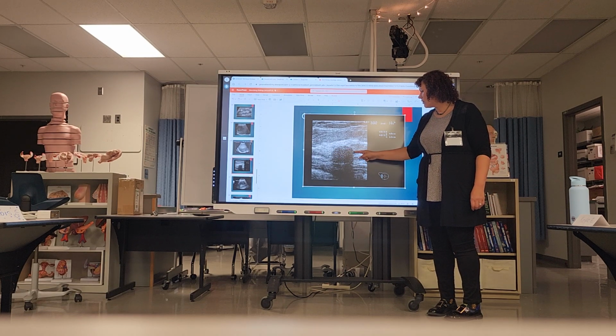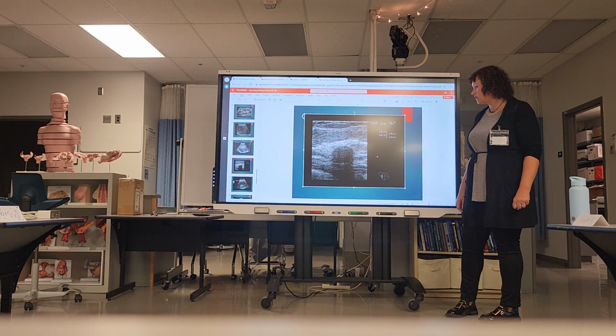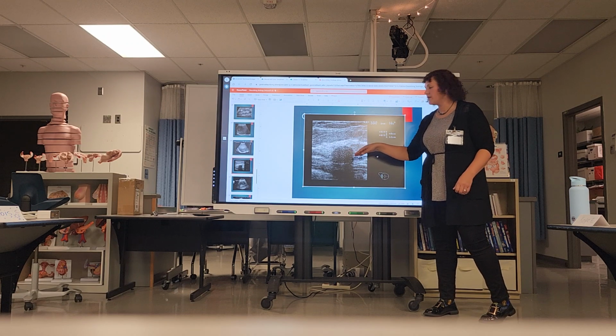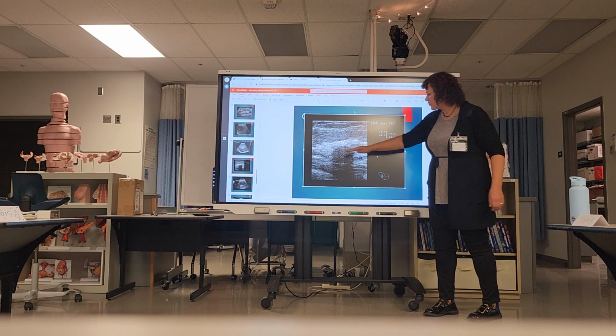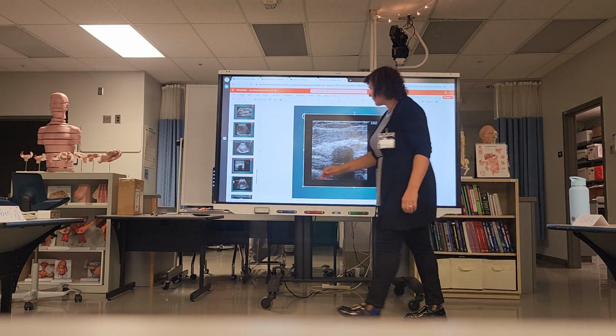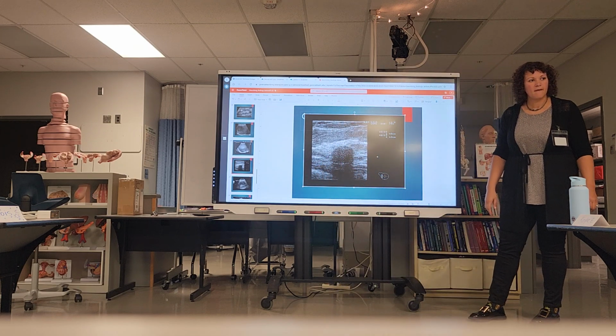Okay, is this a solid or is it cystic? How do we know that it's solid? Shadowing. Yeah, this is really solid. So this is an example of a solid that is hypoechoic. It's really, really dense, and it's creating this posterior shadowing. Do fluid filled ones, or complex ones, never have shadowing? If there's calcified structures inside. Okay.